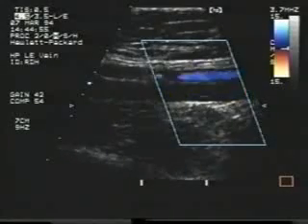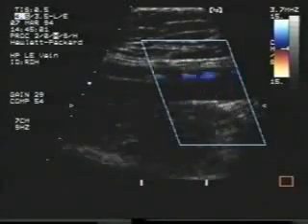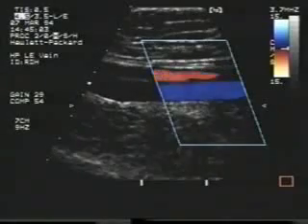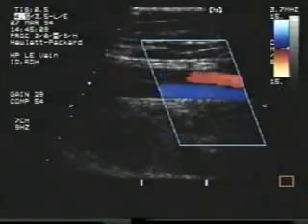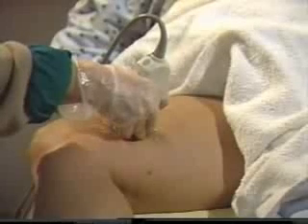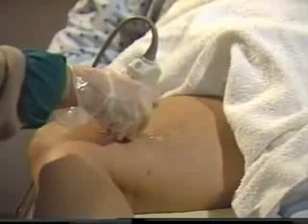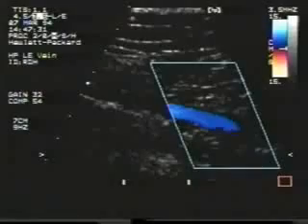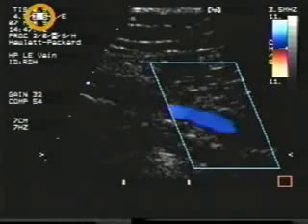Here you can see the vein as it parallels the artery. As you travel along the leg, continue to use color, Doppler, and augmentation maneuvers. You'll find that many people have duplicate veins — just evaluate any you find along the way. At the adductor canal, move the transducer to the medial side of the thigh and follow the femoral as far as possible until it becomes the popliteal vein. Since this is a difficult area, you may need to adjust the image controls to bring in the important parts of the image. You may also want to use a lower frequency transducer here.